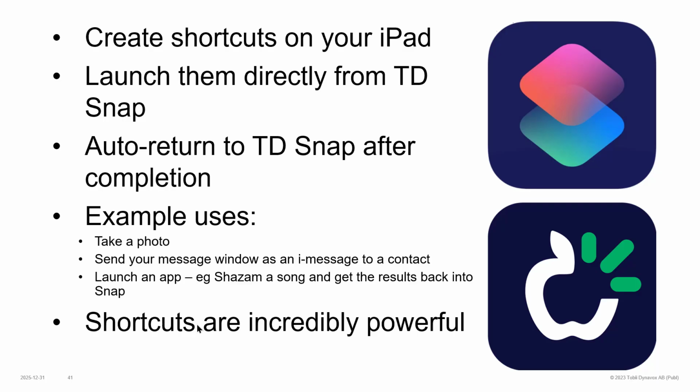For an AAC user, for example someone using TD Snap on a TD Pilot, or someone using switches or direct access on a TD Navio, being able to initiate a shortcut directly from within TD Snap is incredibly enabling and powerful, because it means that the user doesn't have to go out into the iOS operating system and perhaps get lost there, but also that they can complete an action that might require numerous steps with just one button selection.